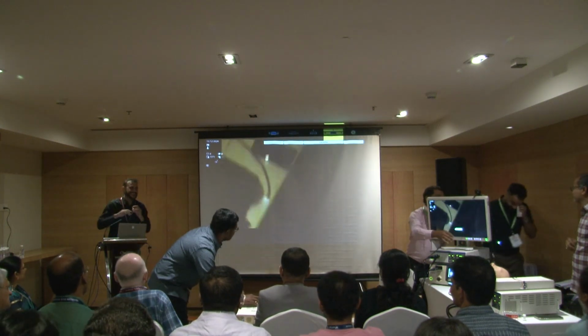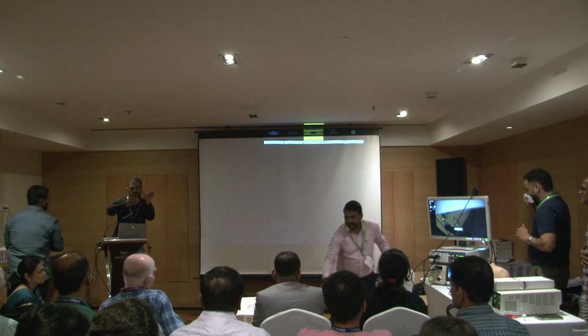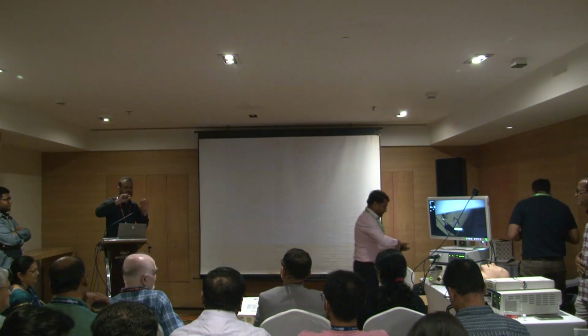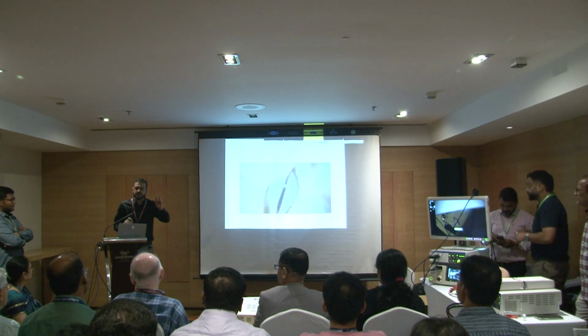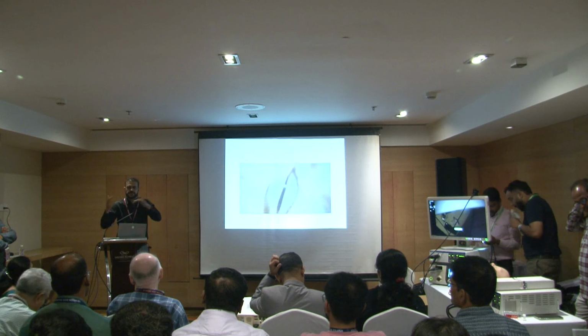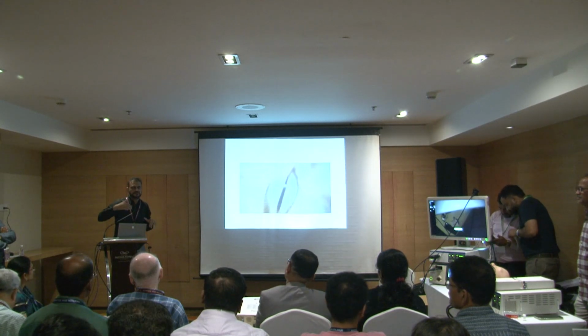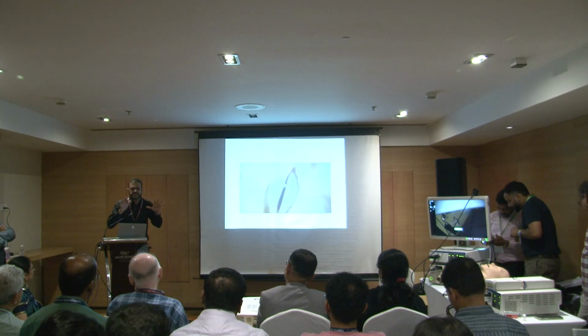Our aim is to see the upper, the middle and the lower lip, all three of them together, and record this. We cannot do an assessment at one point, and it is always good to have three doctors assessing the same view. What we do in our institute is that the speech therapist, my junior and myself all three assess it in different ways and then see whether it is matching or not, because amplitude, symmetry and periodicity are slightly subjective.